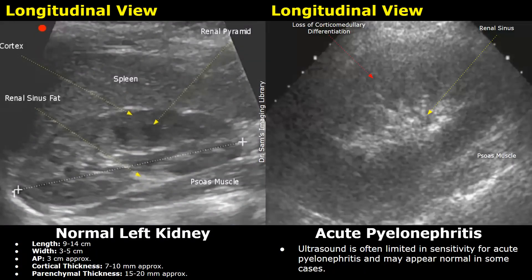We will compare the kidney appearances of a normal kidney with the appearance of pyelonephritis. In many cases of pyelonephritis, specifically acute pyelonephritis, the appearance of the kidney on ultrasound is normal. However, in severe cases, abnormal appearances are seen.